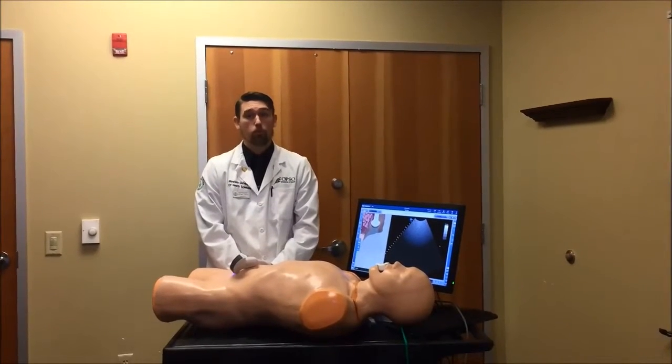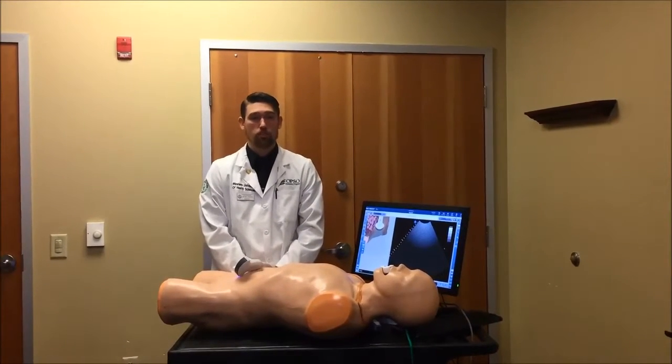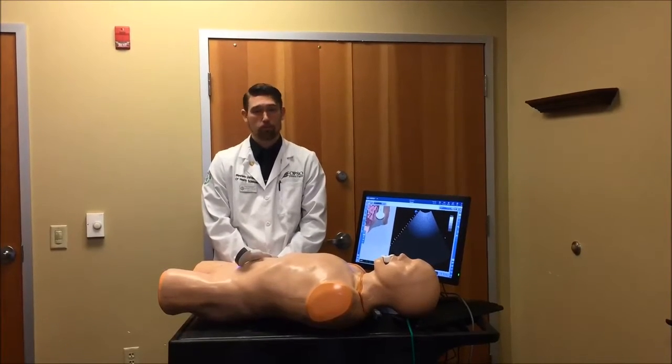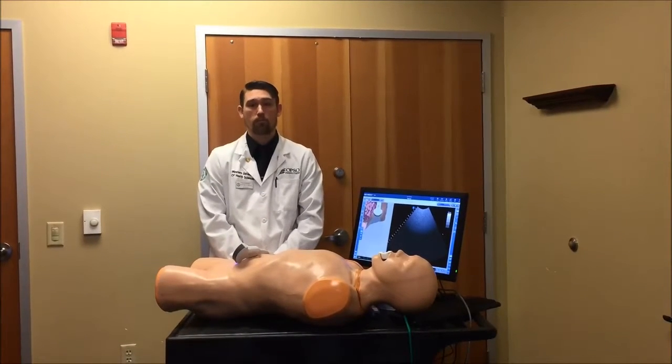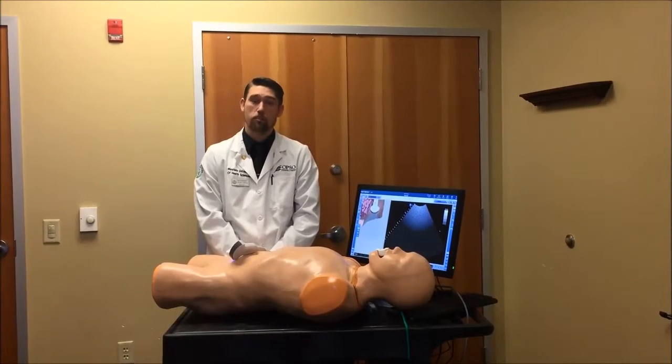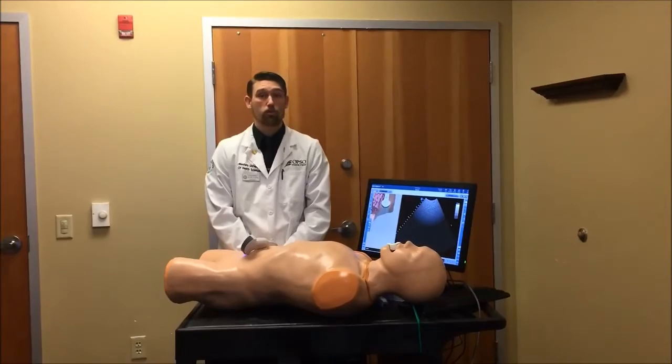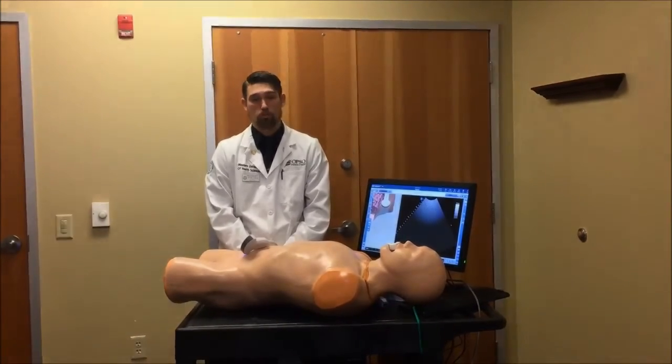However, the subxiphoid view in real ultrasound has limitations due to the amount of tissue the sound waves must pass through while examining the deeper structures. Hence, the more common view through which the heart is examined is the parasternal window. Next, student Dr. Dylan Roper will demonstrate the parasternal views to examine the cardiac structures.